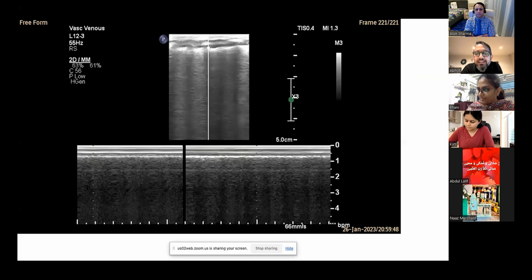That's one thing. And I think the second thing I would have done in this particular image is about the gain. Now I really can't say how much it should have gone up or down, but first thing is the focus, and once we keep the focus, it auto adjusts most of the time, and if it doesn't, then you have to sort of tailor it to get the best of the image there. So yeah, otherwise lovely image.